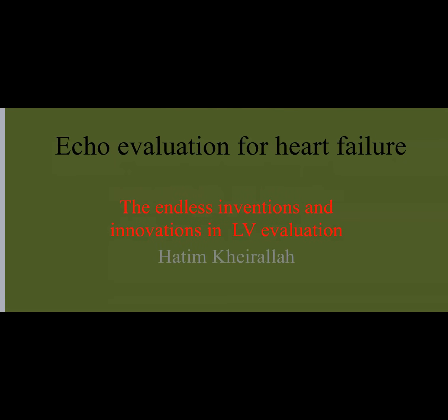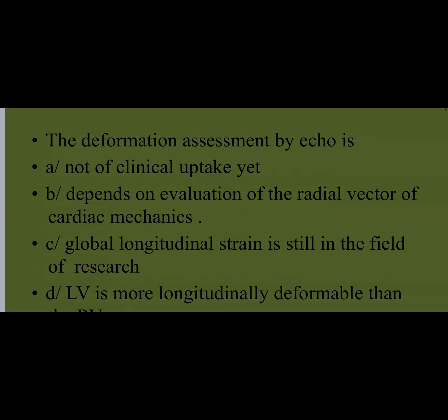This presentation will come in tandem with the last presentation we did together, about M mode, because in M mode we also discussed ways of assessing LV systolic function. I will start with a bit of difficult questions, but don't worry about that, because through the discussion that comes shortly we will know the answers to all these questions. So the first question is the deformation assessment by echo. Deformation assessment is a different way of saying strain and strain rate assessment.